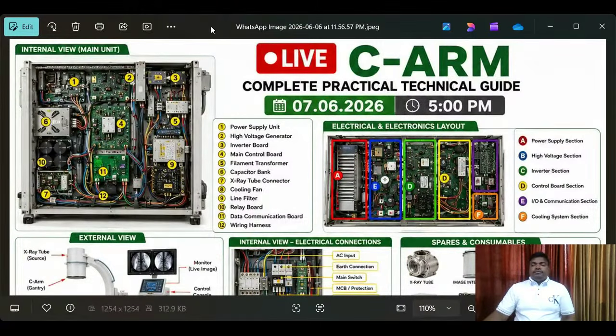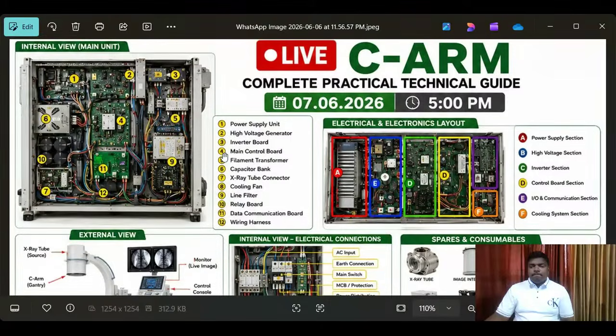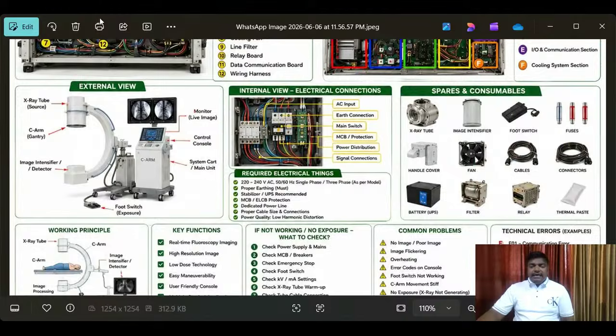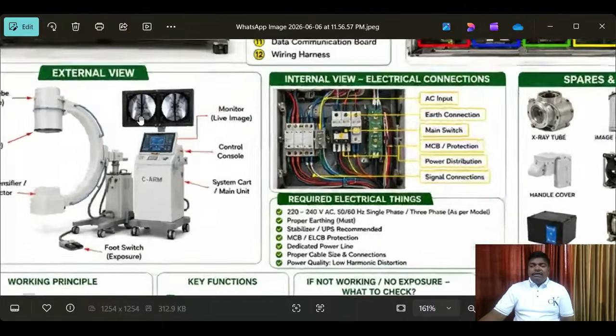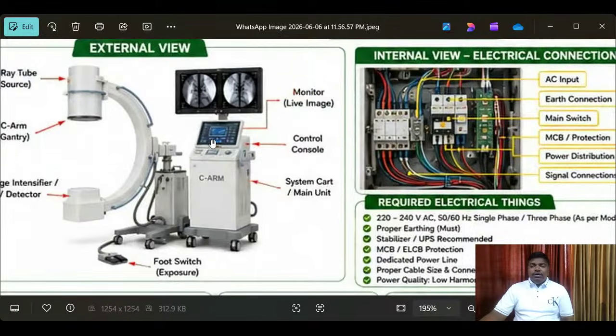Okay, right. Now see here very clearly. I'm showing you live. Now this is the internal part. This is the console part area. This is the console part where you can find it. Here, for your purpose, without confusing, this is the CM. This is the CM I have shown you. My intention here is that this is the console area.